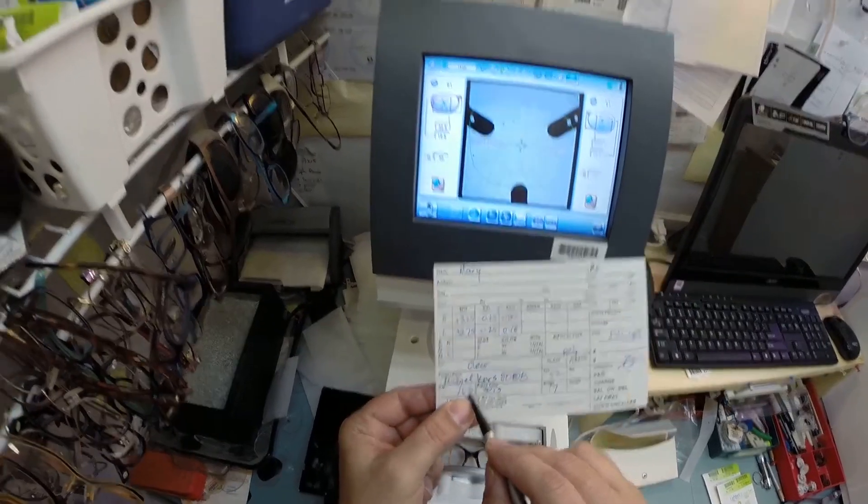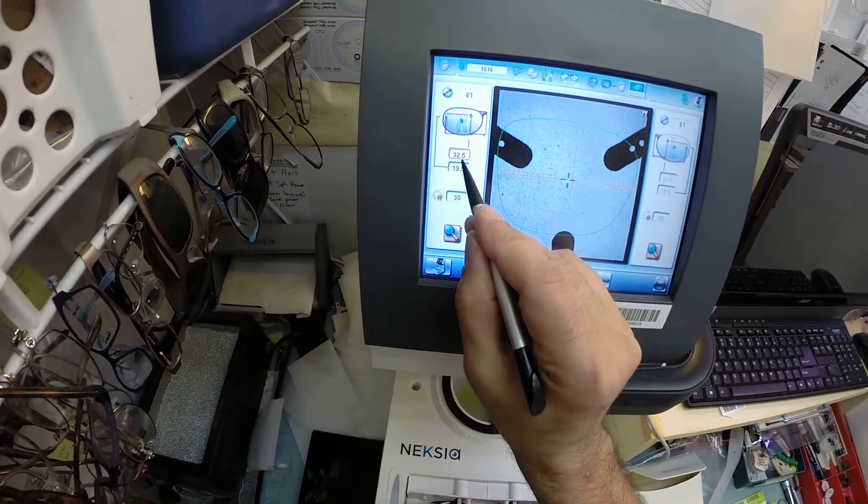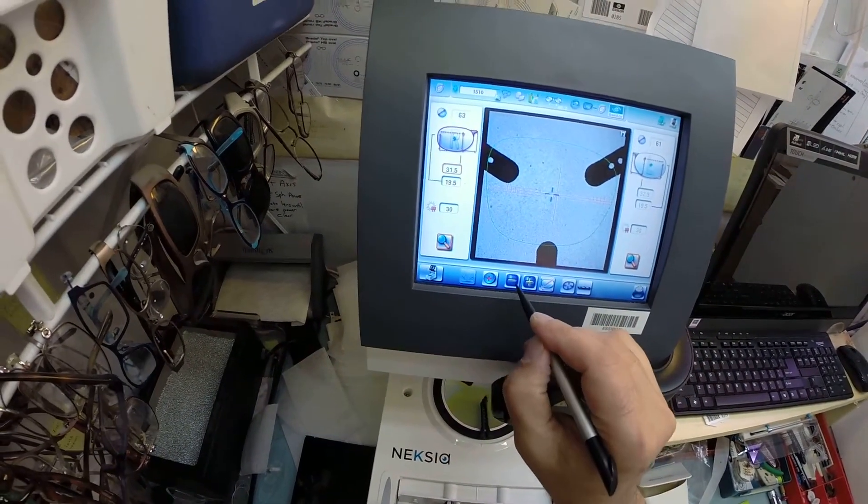So your pupillary distance is 63. The computer starts at 32.5, half of 63 is 31.5. I'm going to put that there. Let's go ahead and get your lenses prepped. I'm going to set that down for now.